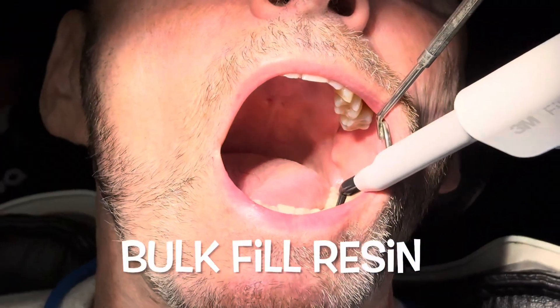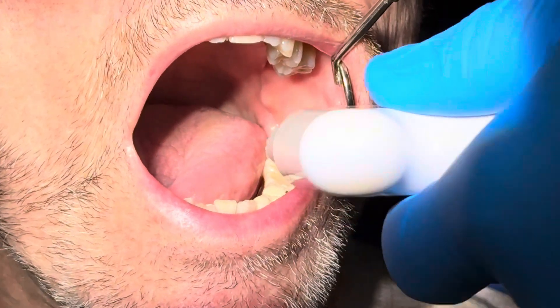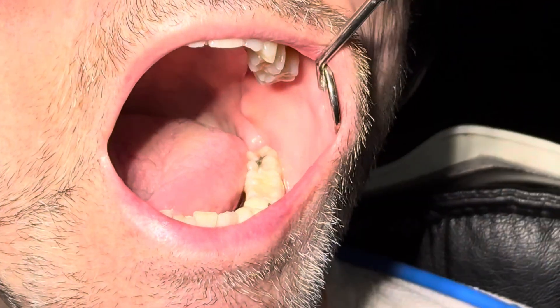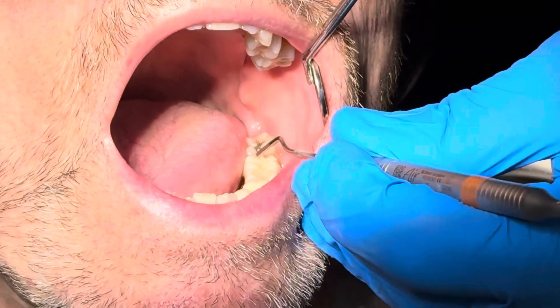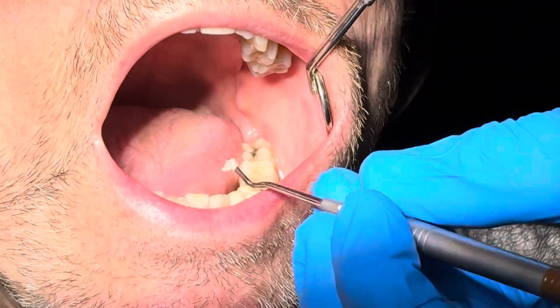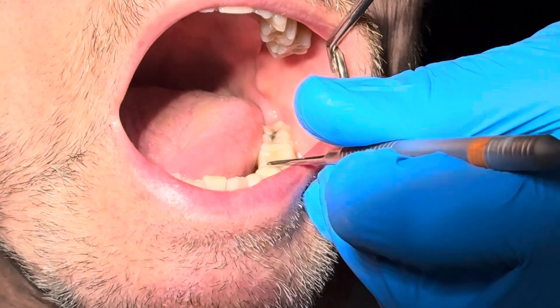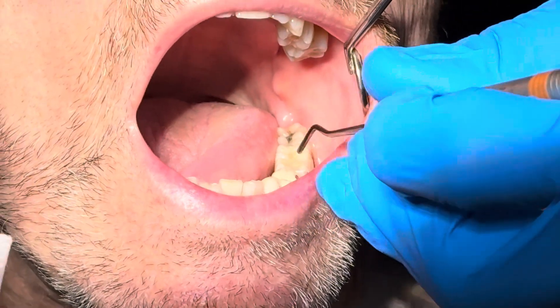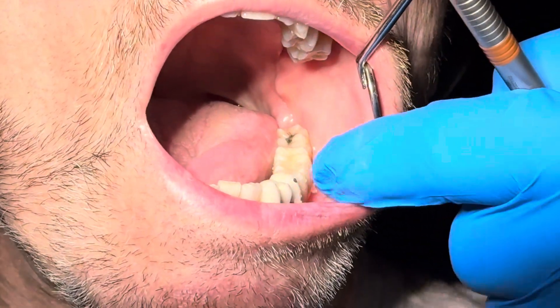We'll take some bulk fill resin and put this in the chambers to fill them with a resin that's a little more durable for occlusion. These bridges take a bit more beating because of the lack of a periodontal ligament — when an implant is opposing a tooth it takes a lot of force, versus opposing a denture which is much easier.